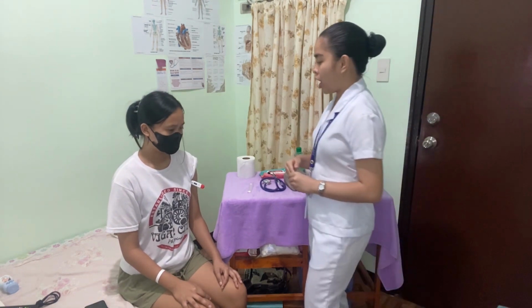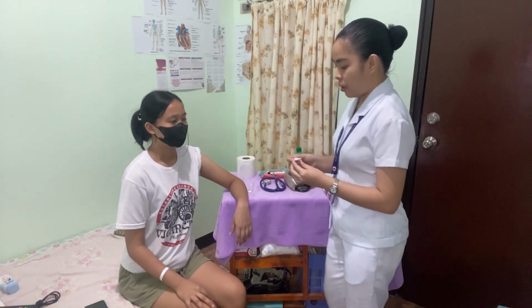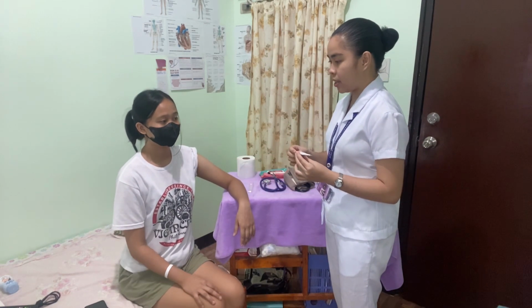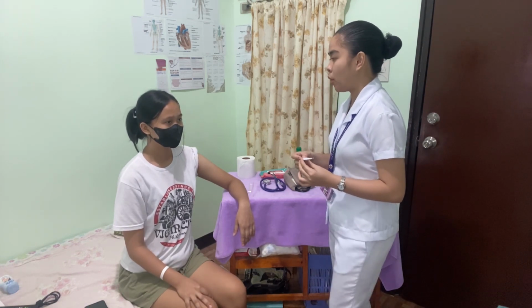Okay, ma'am, lift your arm for a minute. Your temperature, ma'am, is 36.8 degrees Celsius, which is within the normal range.